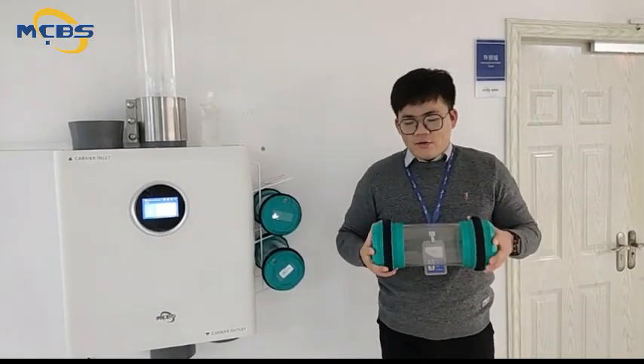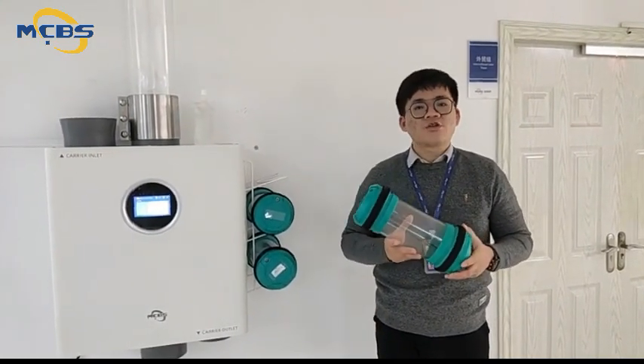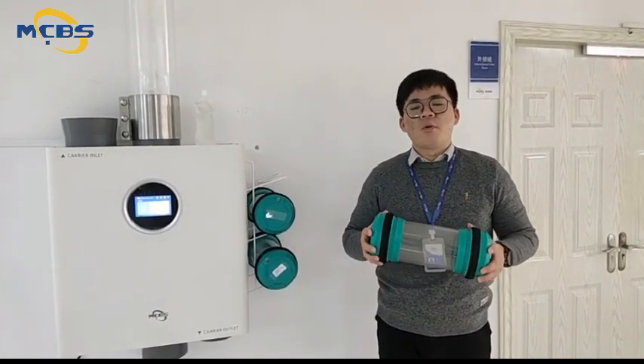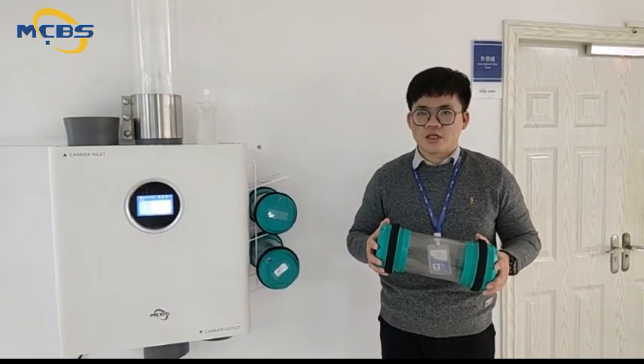Now, here is an exact carrier. Its diameter is 160mm, which is commonly used to transport small infusions, plasmas, paperworks, and for medicals in hospital.